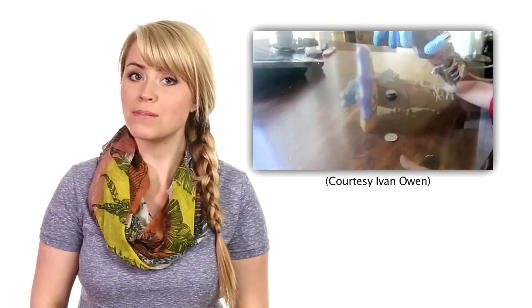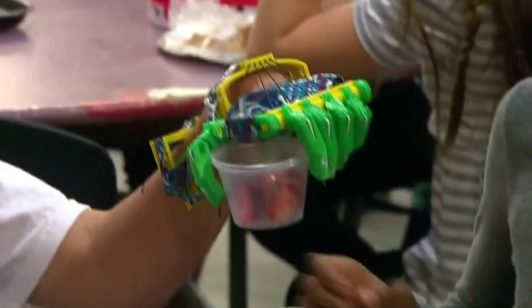Searching for a way to help his son, he found a Robohand video that showed how to make a prosthetic hand using a 3D printer. After borrowing a 3D printer from a friend — it was actually incredibly convenient that he had a friend with a 3D printer — he took a bunch of strings, bolts, and screws and made Leon a brand new 3D-printed hand that's able to perform tasks like picking up a water bottle and holding a pencil, all from a 3D printer.